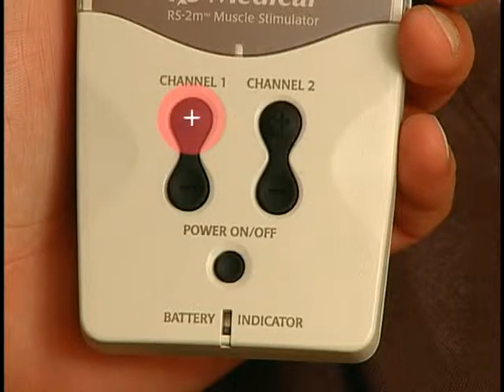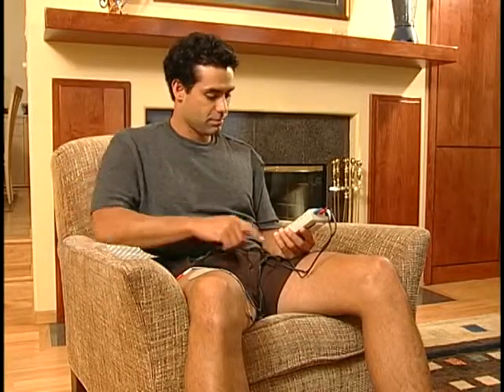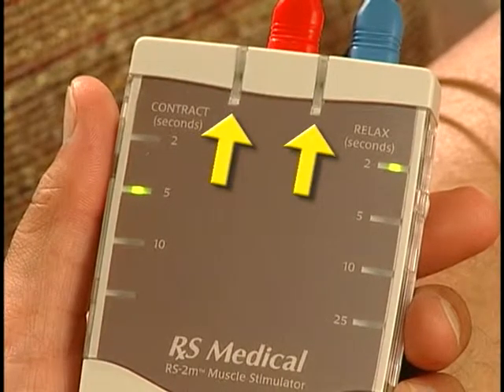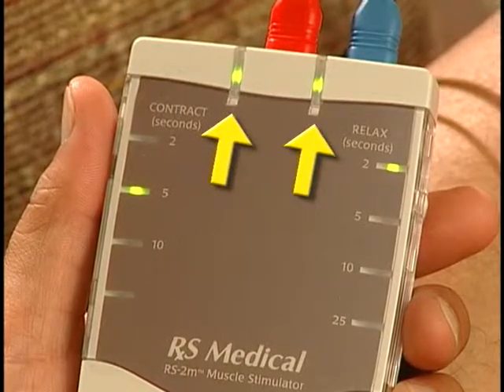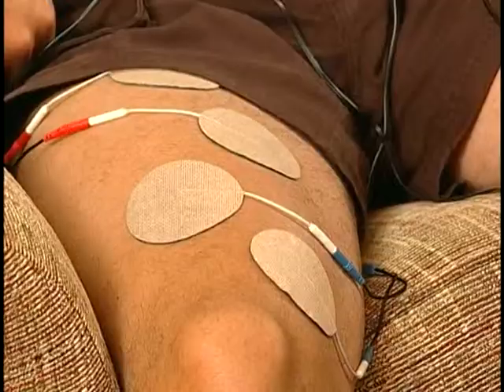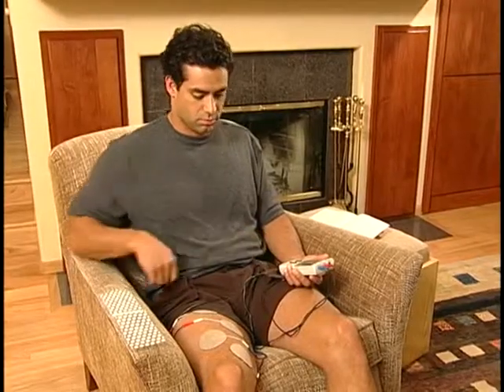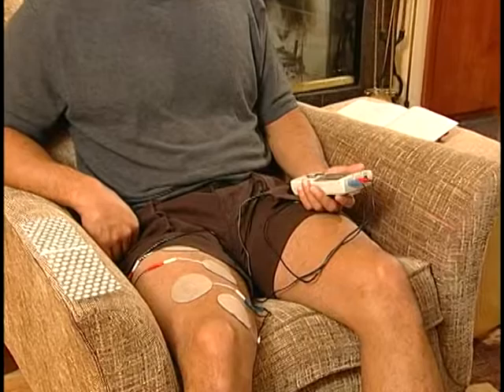Press the plus end of either key to start the treatment and to increase the intensity. Press the minus end to decrease intensity. The keys will click and beep when pressed correctly, and the channel indicator lights will turn on to show you when stimulation is being delivered to the pads for that channel. For comfort, only increase the intensity of a treatment when the channel indicator light is on. As you increase the intensity during a treatment, you may feel a tingling on your skin and your muscles may contract — this is normal. Increase the intensity as instructed by your medical professional or RS Medical representative, then relax and allow the stimulator to treat your muscle.